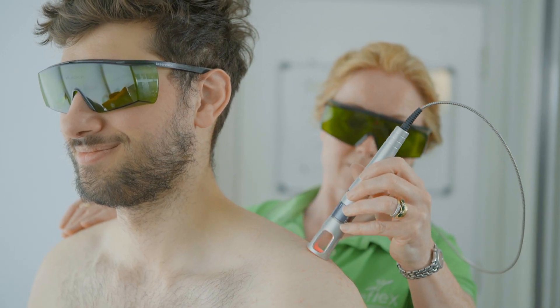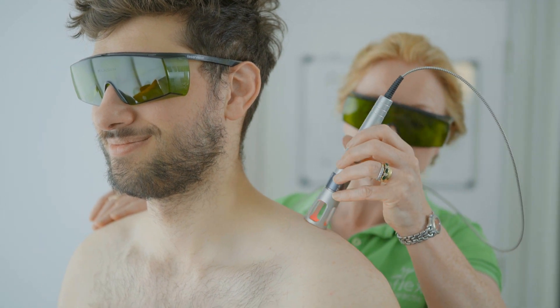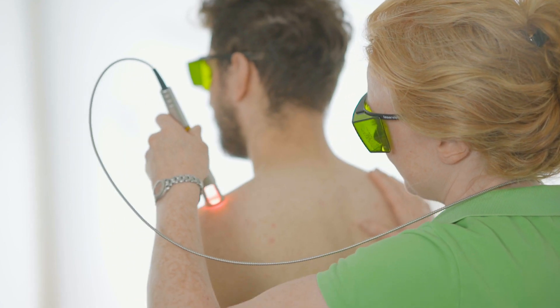So what should you expect when you have a laser treatment? It's not a one-hit wonder — you will need to have a course of care. The experience you'll have during treatment is just a warming sensation due to the stimulation of the deep capillary beds.